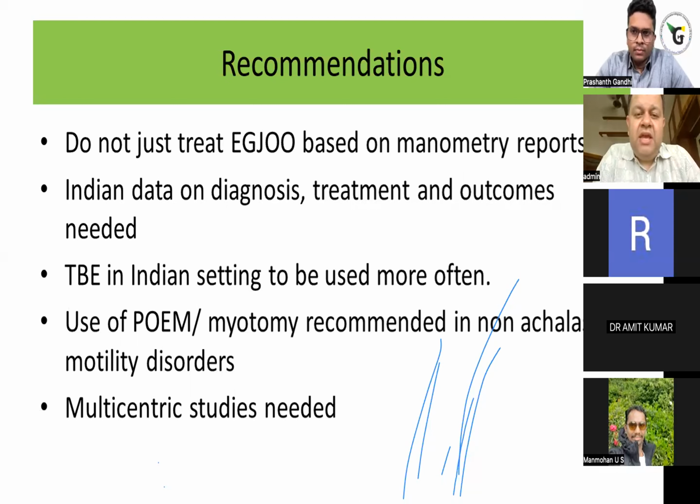Indian data on diagnosis, treatment, and outcomes is very scanty. Hardly 1 or 2 studies have shown EGJ outflow obstruction. However, we do not have any significant Indian data on treatment and outcomes of EGJ outflow obstruction. Timed barium esophagogram should be used by all of us in our clinical setting because it's a simple test that is available to all of us, and it shows whether the esophageal emptying is normal or not.